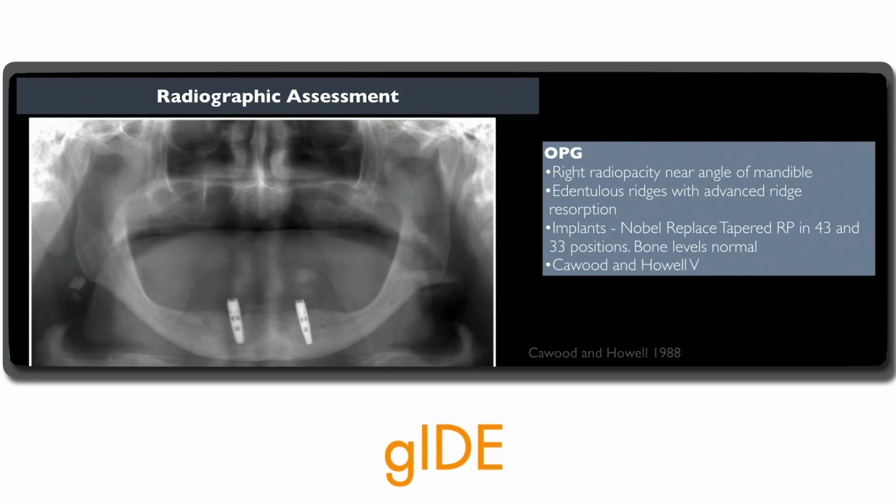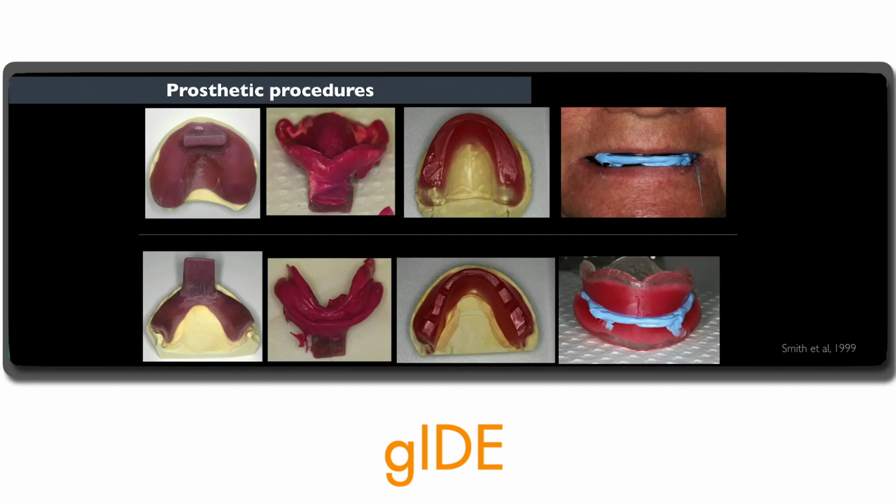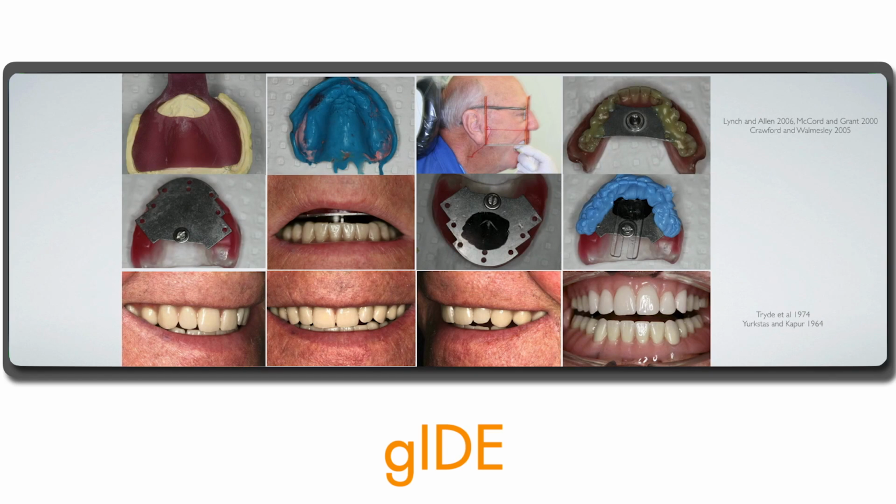So there's the OPG of the implants. A new prosthesis was made, with custom trays, wax rims, and a new MMR. Because of the flabby maxillary ridge, this patient had an open window technique to take the impression. So we have a mucostatic impression, not applying any compressive pressure on the mucosa as we take it. And a Gothic arch MMR was undertaken for centric relation recording.